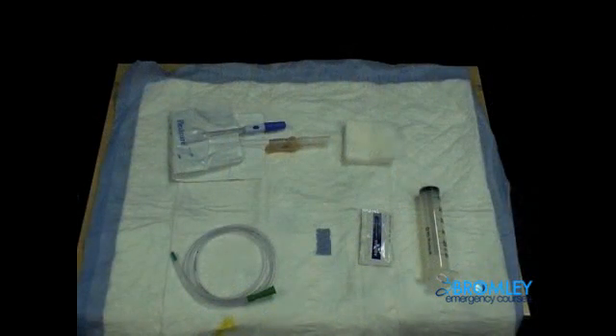Take a moment now to familiarize yourself with the equipment seen above and to think about the indications for placing a nasogastric tube.